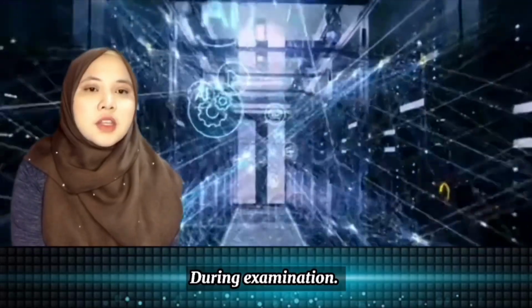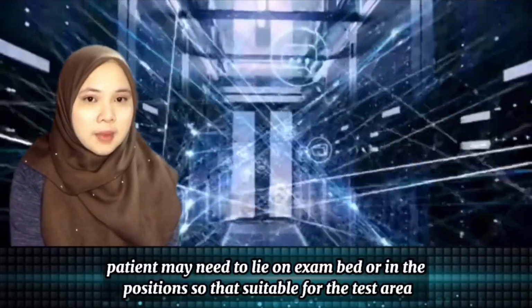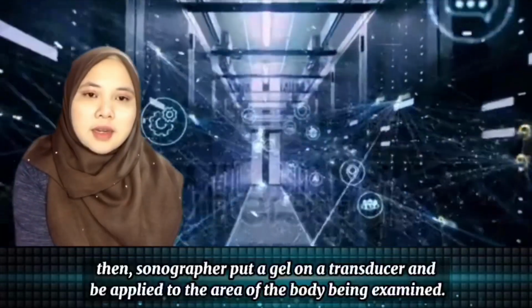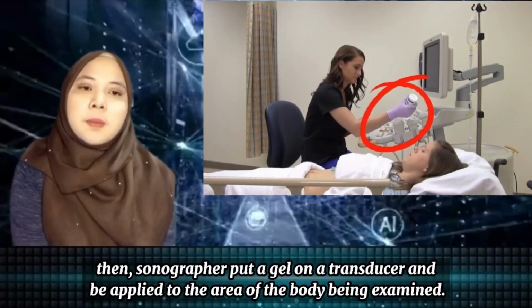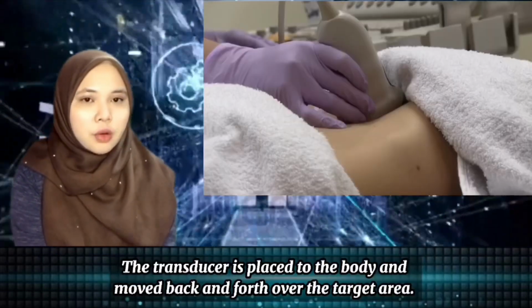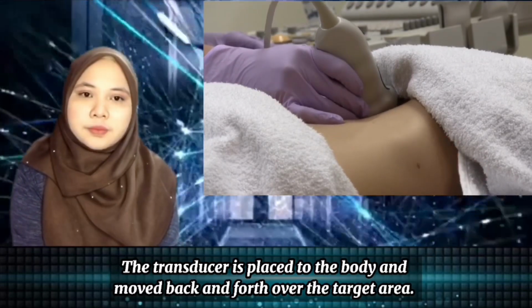During examinations, the patient may need to lie on the exam bed or in a position suitable for the test area. Then, the sonographer puts gel on the transducer, which is applied to the area of the body being examined. The transducer is placed on the body and moved back and forth over the target area.